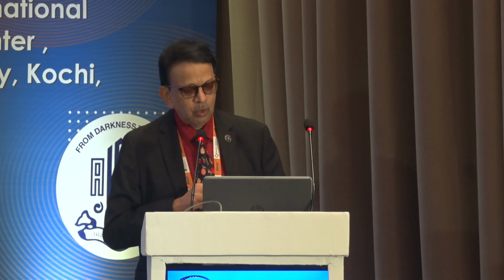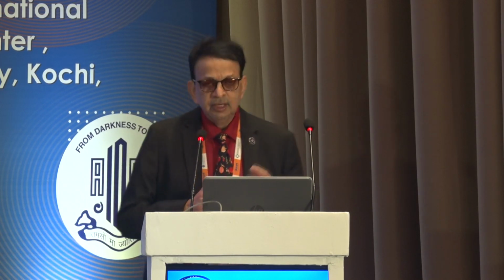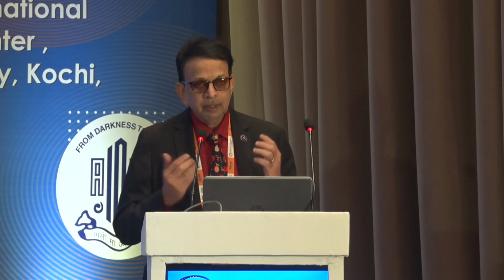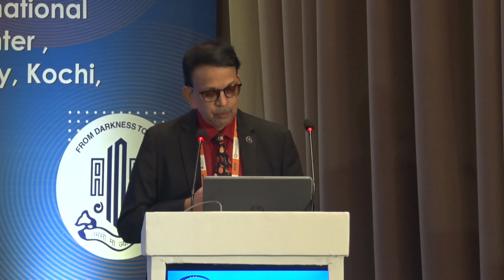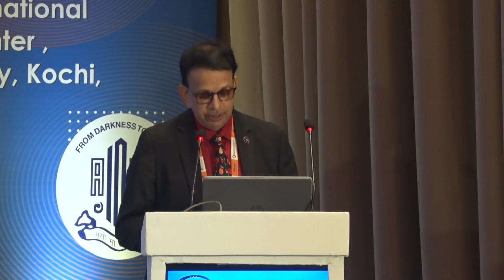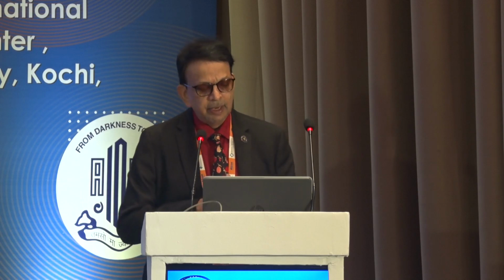It's like a piece of granite inside the eye, and you can see how big the cataract is. It's nucleus and more nucleus, no epinucleus, not much cortex as well. What is the challenge? The challenge is difficulty to crack the nucleus because of the leathery posterior nuclear plate, thin posterior capsule, large nucleus, poor or no cortical cushion, increased incidence of corneal edema and postoperative corneal decompensation, and increase in the PCR.